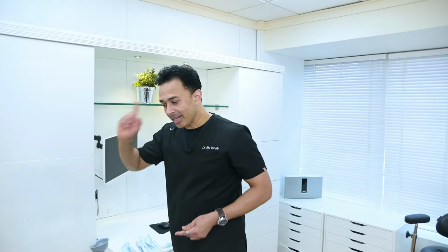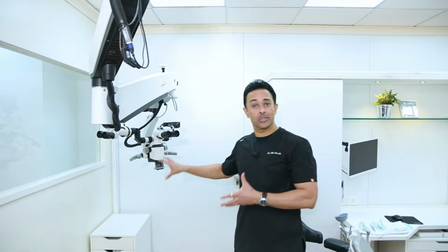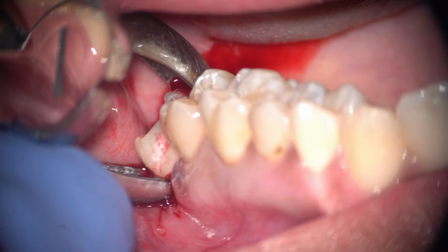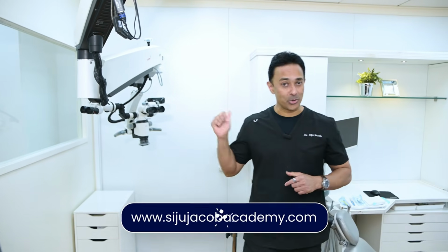And finally, the microscope. We do everything through the microscope. There is a way to do this. We do general dentistry through the microscope, not just endodontics, everything in general dentistry, including clinical examination, oral prophylaxis, restorations, crown preps, even extractions we do through the surgical microscope. And we teach you how to do most of these things in our online course.